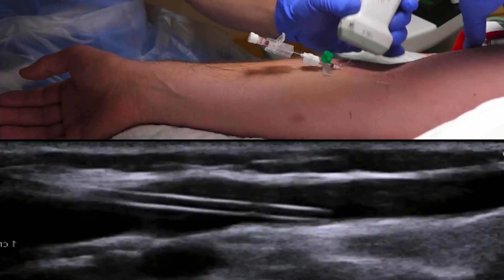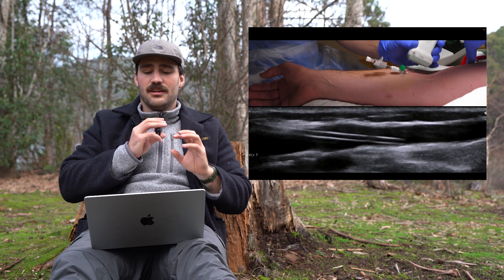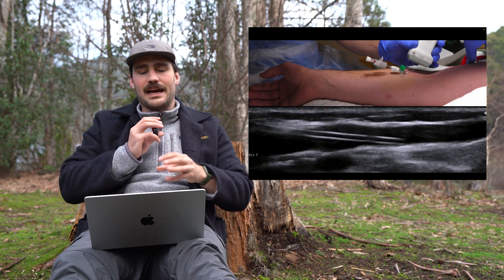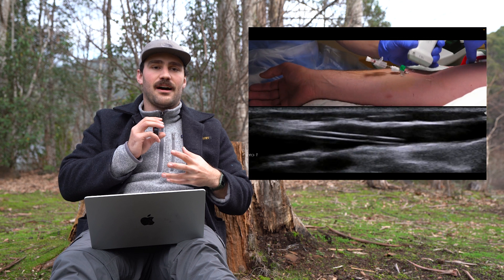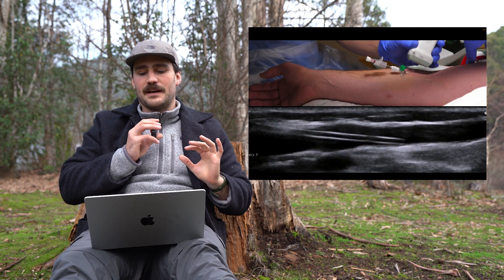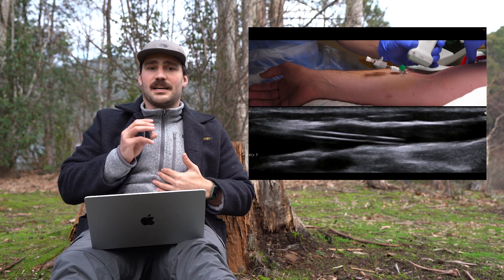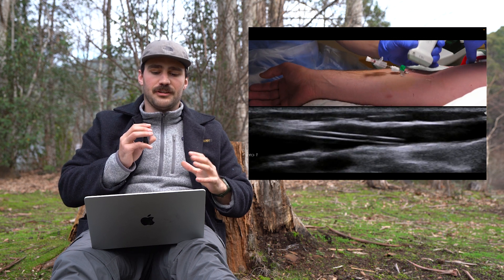The plastic tubing is what sits in the vein. You can now see the plastic tubing in the vein, which is that black rectangular portion on the ultrasound screen. The blood is in the flashback chamber and also in the tubing. All we've done is put the needle in, gain access to the vein, put the tubing in, and remove the needle. Now we just need to secure it all in place so we have a good access point to deliver medication, take blood, or whatever we need to do for this patient.